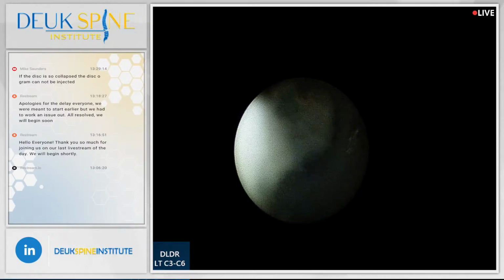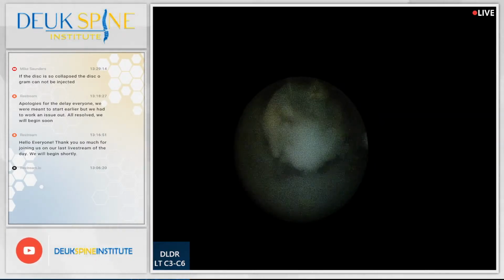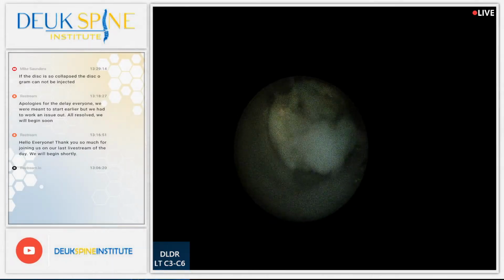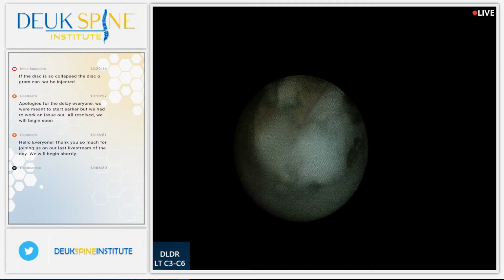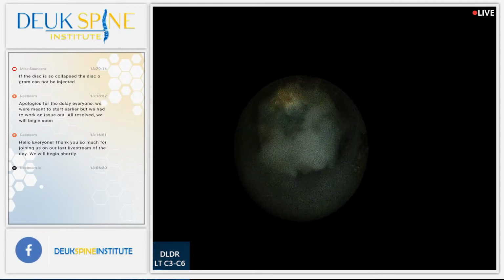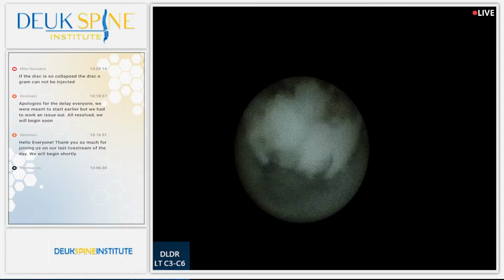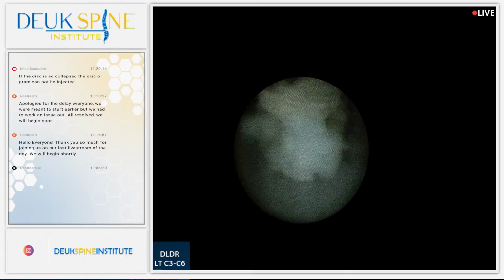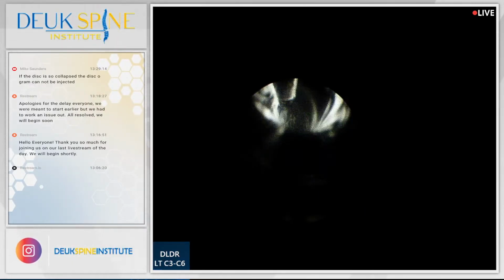You increase it? That's probably a little better. How much can this fiber take? This 0.5 millimeter fiber, does it say? Gotta find out. I'm sure it can't take 100 watts. Grabber. Look at all that herniation there. Lots of it.